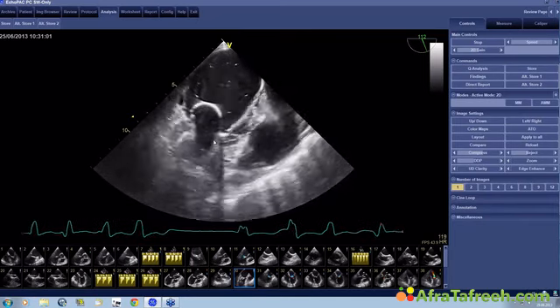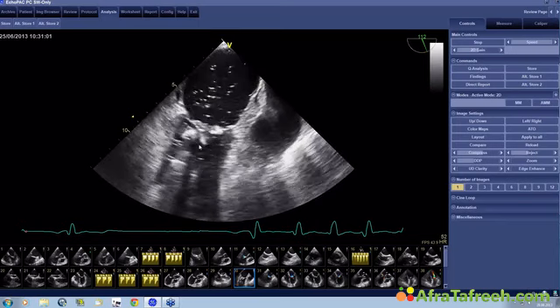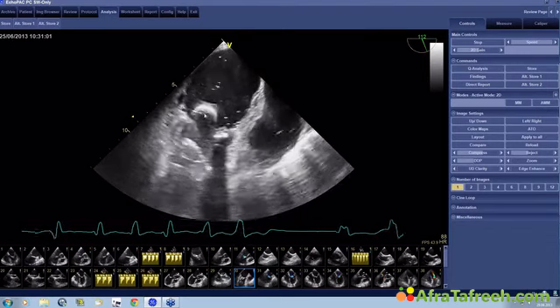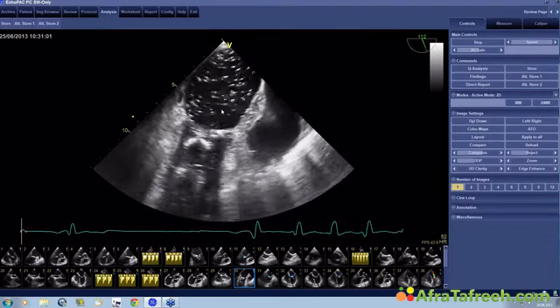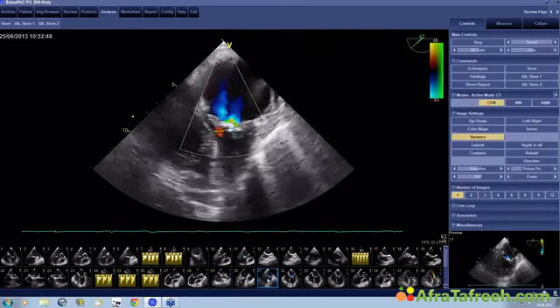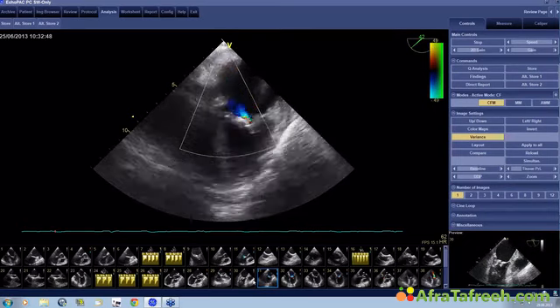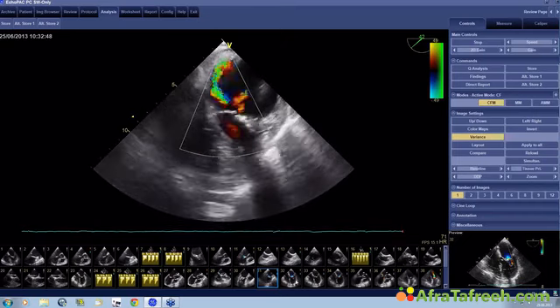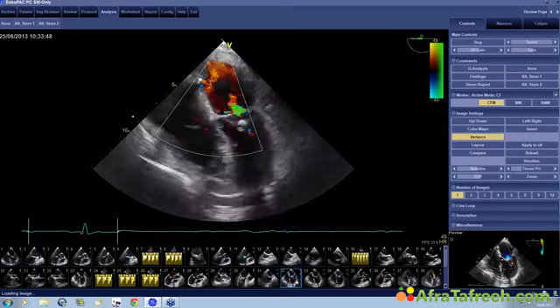And this is what we did, and you can see that in the moment we do this, the balloon also popped because of the calcification. You see that there is contrast all of a sudden coming from the balloon. But we were able to pop the valve, and after that what we usually do is look at the echo for mitral regurgitation. And this is what we found after the procedure.